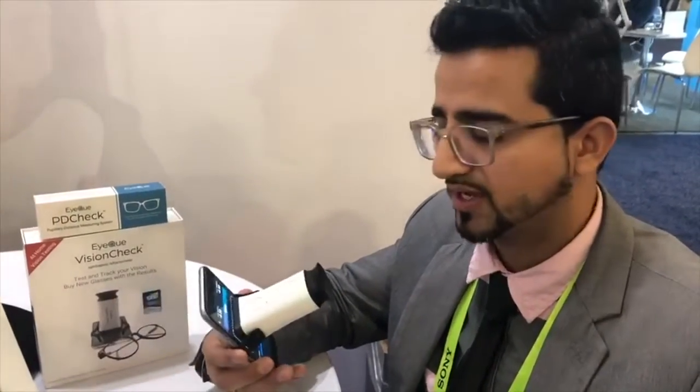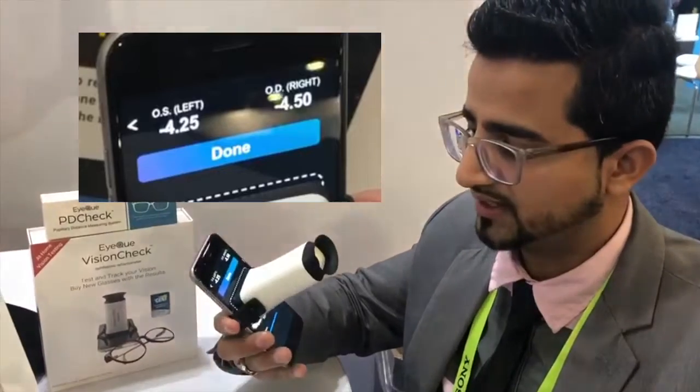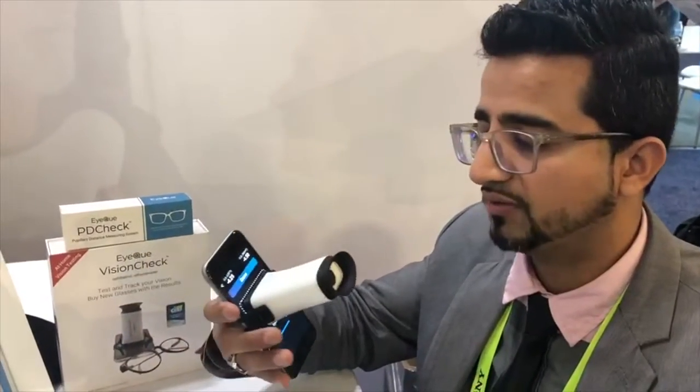It's amazing because it gave almost 100% result. Mine was 4.25 and the other one was 4, so I'd say this is around 95% accurate. The product seems very good because it's giving you the right, exact, accurate measurement of your eyes. With this, you might not even have to go to the doctor as often, because in Canada they charge anywhere from $80 to $120 per visit.